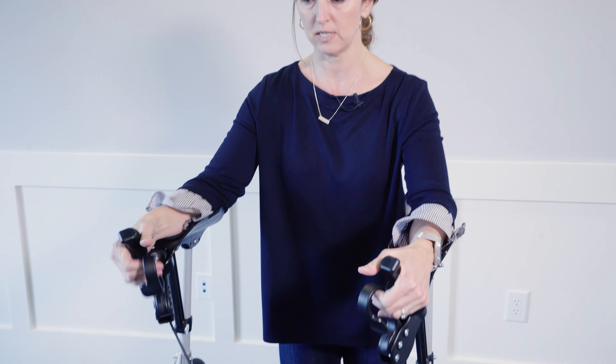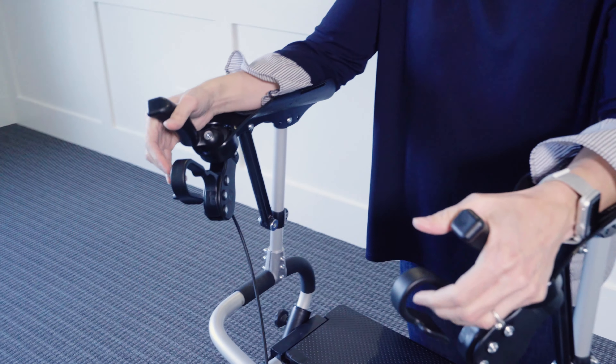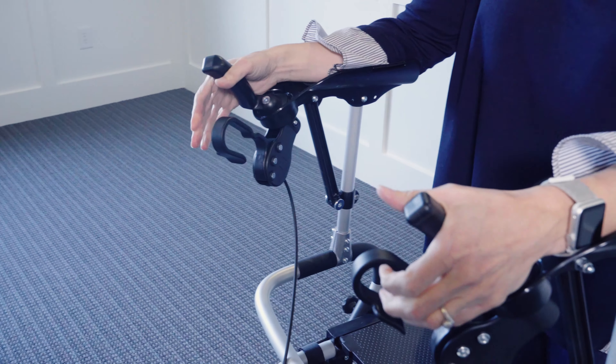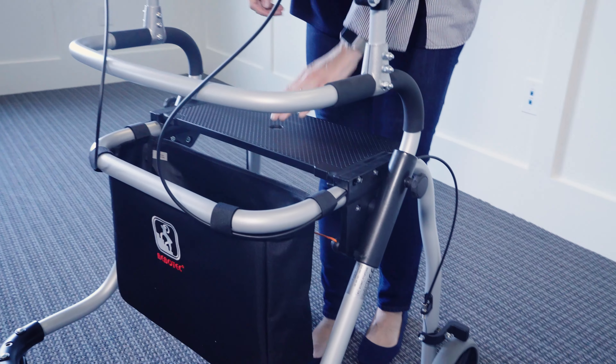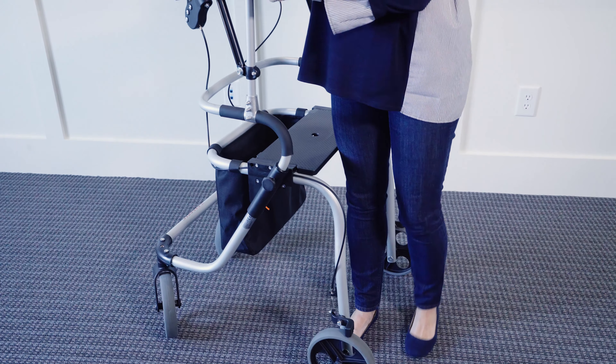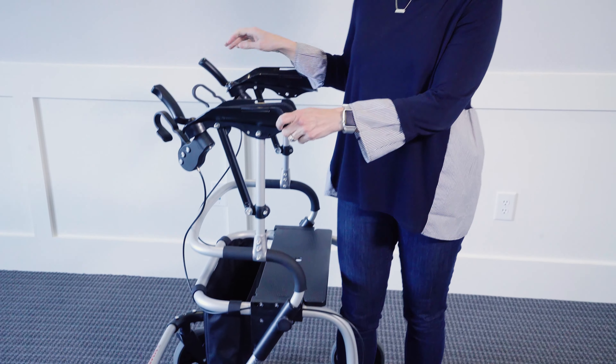Up here, and so easy to access, are the brakes — and they work wonderfully. It's very stable and has a nice seat that's really secure. This is the size large; it's a little bit too tall for Sophia, but it's great for someone like myself at five feet five inches tall.